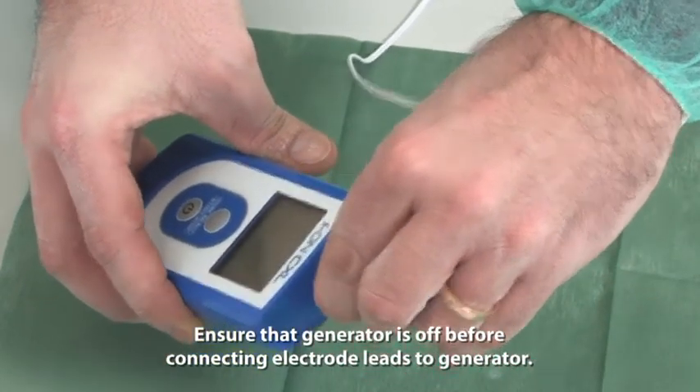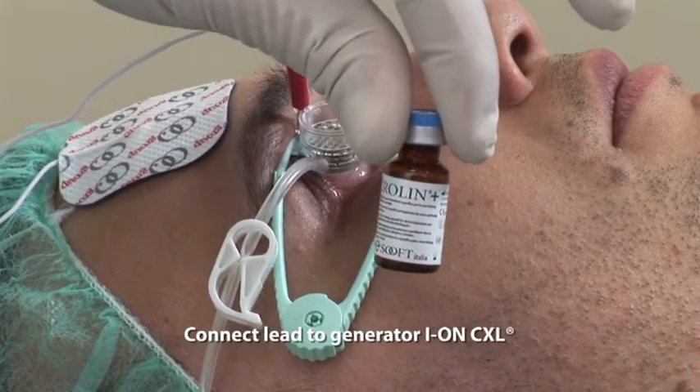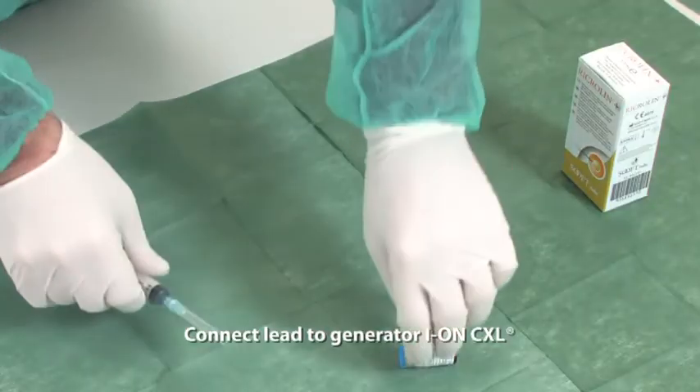Ensure that the generator is off before connecting electrode leads to the generator. Connect the lead to the generator IonCXL.